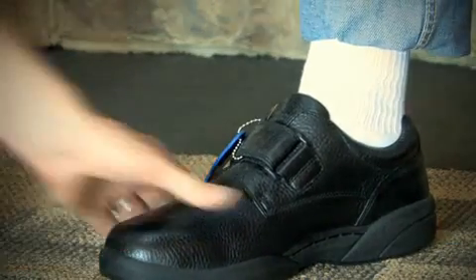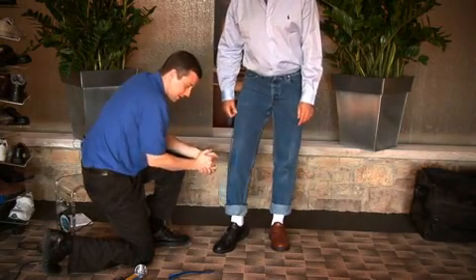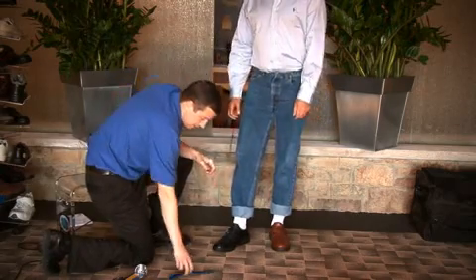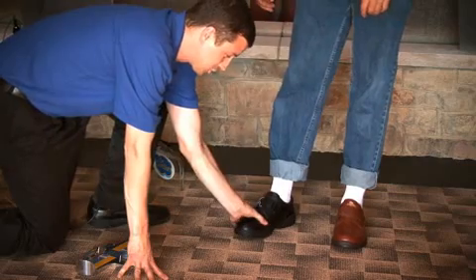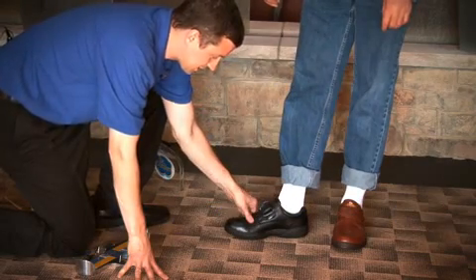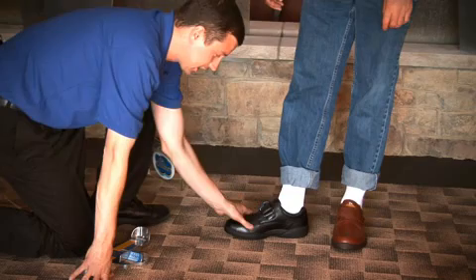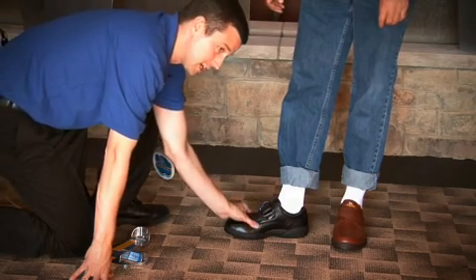Again, based on the determination here, I would say that this gentleman is a 10 medium rather than a 10 wide. Depending on our style, that also might make a difference. Another useful tip after checking the width and length of the shoe is checking with your thumb and index finger, seeing if you can grab any sort of leather. Because I can grab that leather just like that, we definitely know that this shoe is too big. Again, the wide is not sufficient for this patient, so more than likely we would go to a 10 medium.